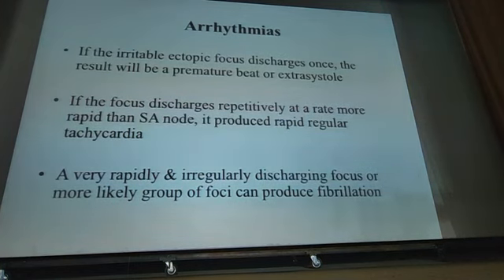Why do we have ectopic? For example, there's a focus here, showing the location here. Now, after the whole discharge, it discharges spontaneously. Why? There could be another ectopic or extrasystole, or in AF, for example, it could be due to dilation of the atria, or dilation of the ventricle. Cardiac dilation of the cardiac muscle.